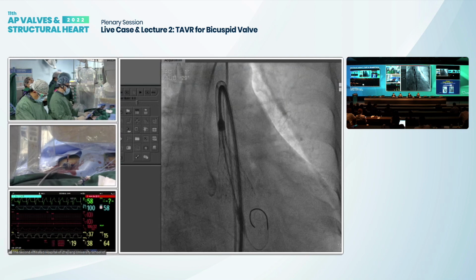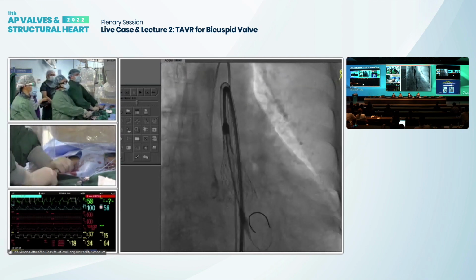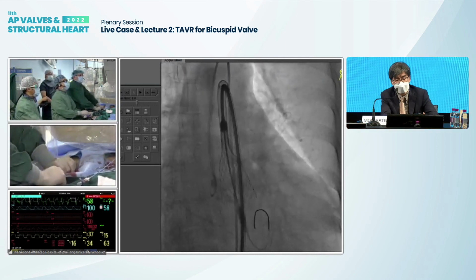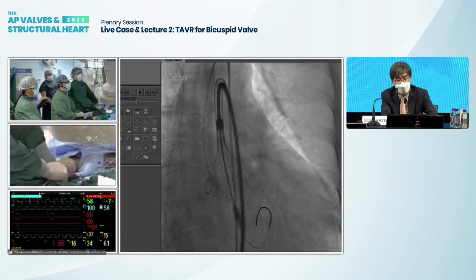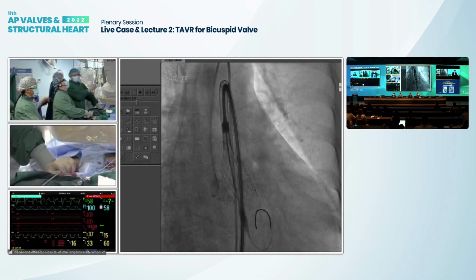We can try that, but it's very hard. Okay, one more. Yeah, this is the situation. Last time we cannot retrieve too many. A little bit higher. Yeah, it's good. Sure. Maybe go back to the first position.